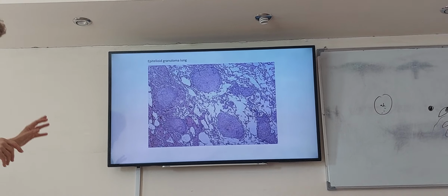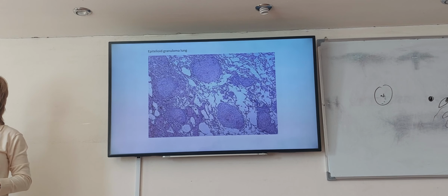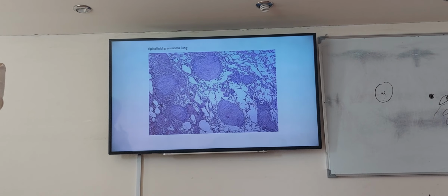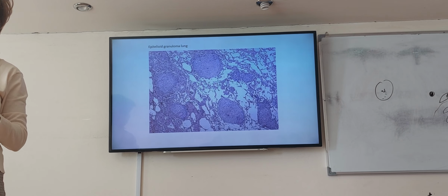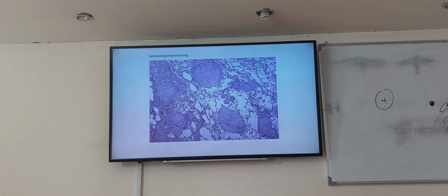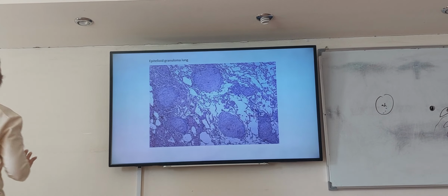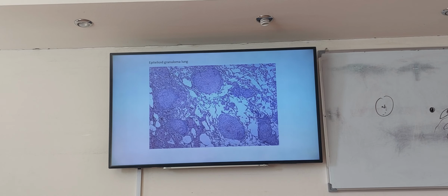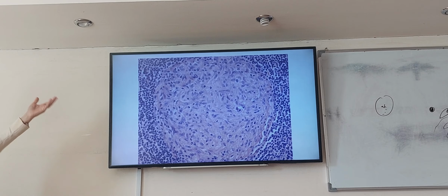You see instead well-defined structures, because epithelioid granulomas are well defined. Remember, histiocytic granulomas are not well defined; you catch them from multinucleated giant cells. But the epithelioid ones are well defined, which means that you look and see well-defined nodular structures. Now, they are eosinophilic, so you start thinking of granuloma. You need a second one. This is the second, so it confirms the diagnosis. What is the diagnosis?